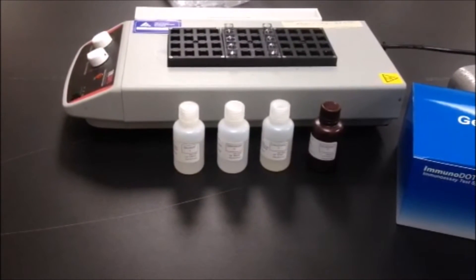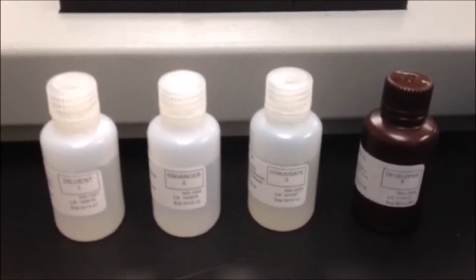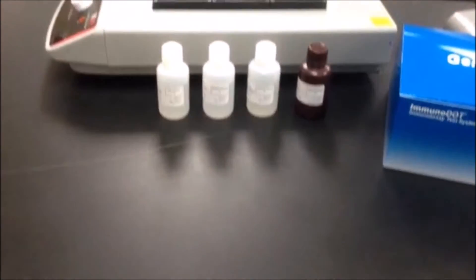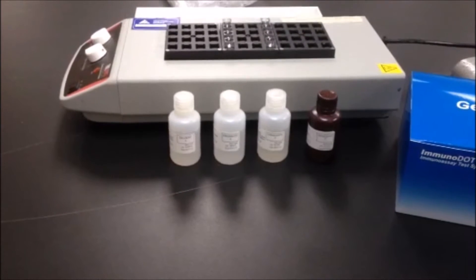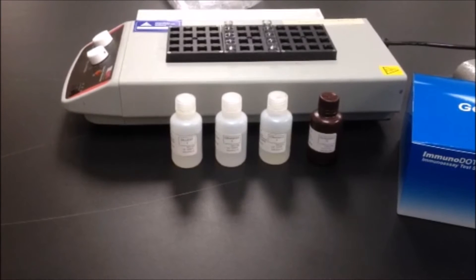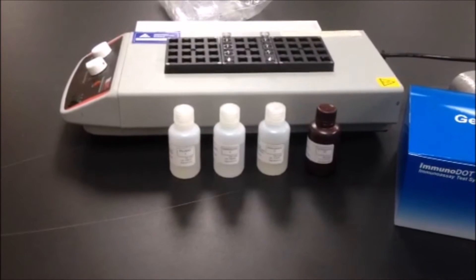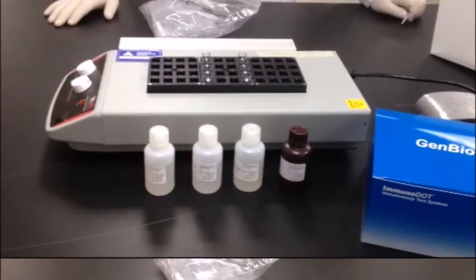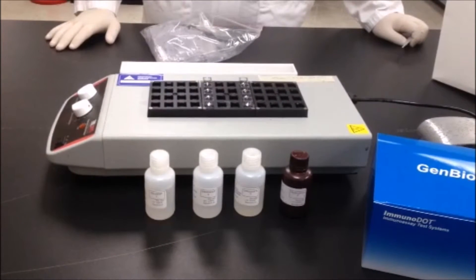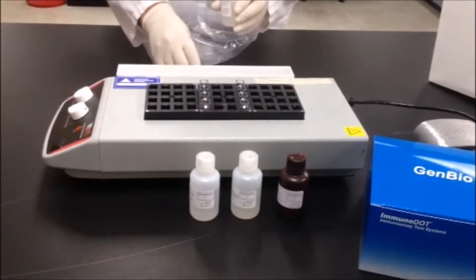The reagents in an immunodot kit are labeled one through four. Reagent one is patient diluent. Reagent two is an enhancer reagent which improves assay stringency. Reagent three is a conjugate used to bind and mark patient antibodies which may bind the antigen on the reaction strip. And reagent four is the developer used to make the reaction visible to the naked eye. Fill the reaction vessels with two mLs of the kit reagents one through four, with reagent one followed by reagent two, three, and four.